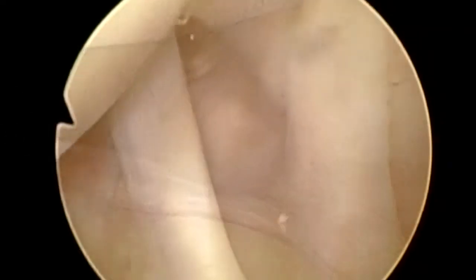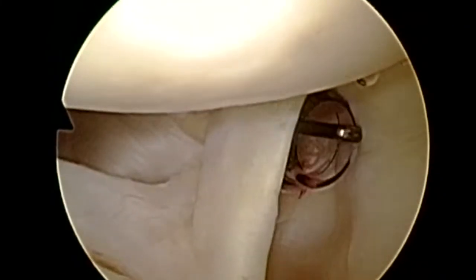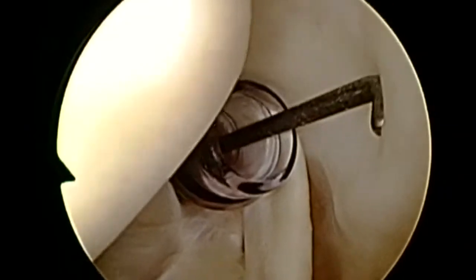We're going to show a quick case of a capsular release. This is a pleasant 42-year-old female who injured her arm in a fall. She actually had a mid-shaft humerus fracture that was fixed surgically.